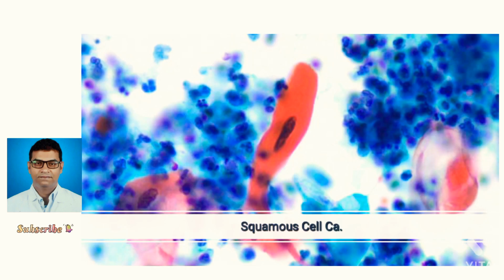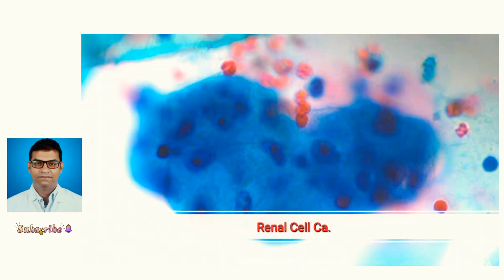This is a beautiful picture showing the cells in a squamous cell carcinoma urine sample. And this is a urine sediment stained showing renal cell carcinoma.